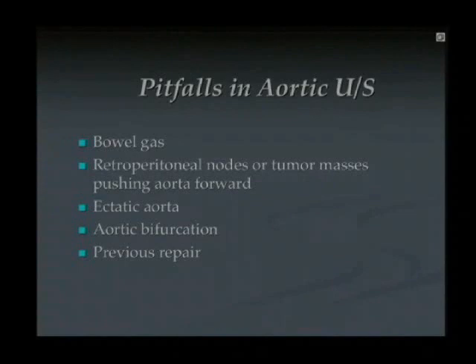Maybe a blunt question, to be blunt. If you have a hemodynamically stable patient, why not just go to CT? Good question. Hemodynamically stable patient, should you go right to CT? Absolutely. Is the tech there right now? Tech is right there? Yes. Radiologist right there? No, but you can get it read by teleradiology within 30 minutes. So if it's a hemodynamically stable patient, well, then it doesn't matter. Then you've got great backup. 30 minutes is not bad.